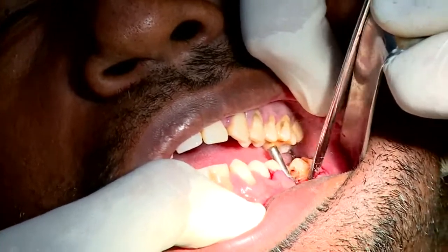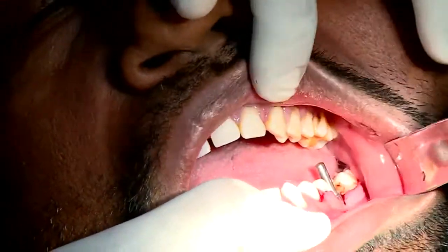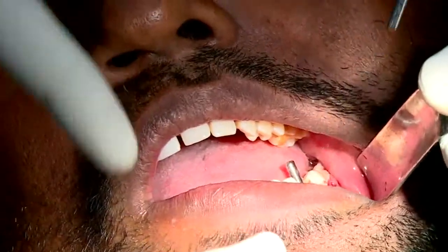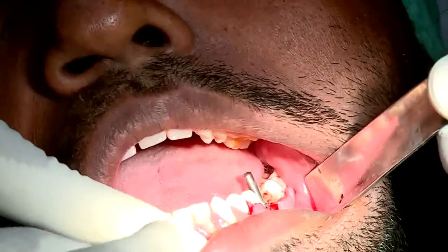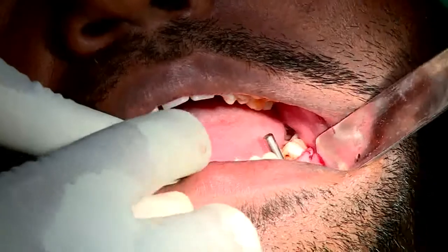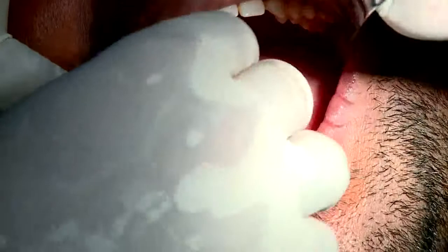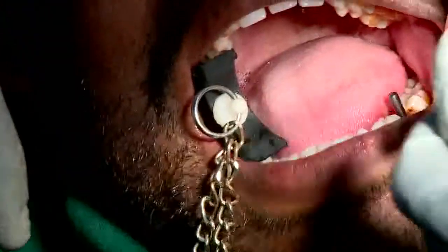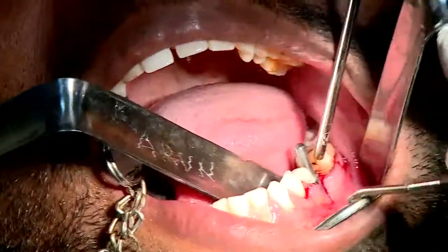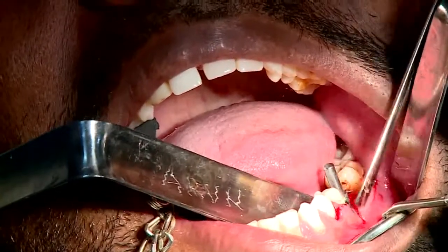Now, this is exactly what we said. We need to make sure that our implant is going to be useful for the patient. There's no point in putting a titanium structure which will eventually integrate, but you can't give a tooth on it, right? So that is why we were talking about a prosthetically driven approach. Any questions on the implant directions so far, Dr. Yasser? Yes, this looks fine, sir. Absolutely fine. I am actually waiting for comments from Dr. JK.